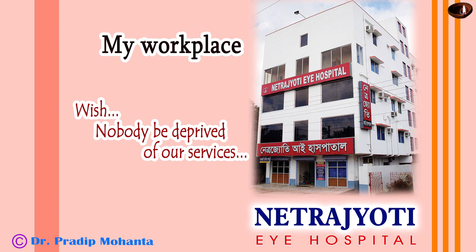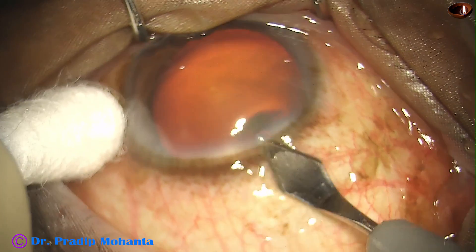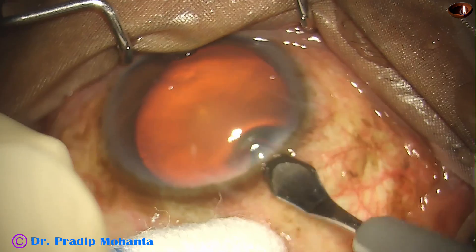Friends, welcome to my workplace at Rana Ghat, West Bengal, India. This is phacoemulsification of a soft cataract. Let us observe the surgical steps.